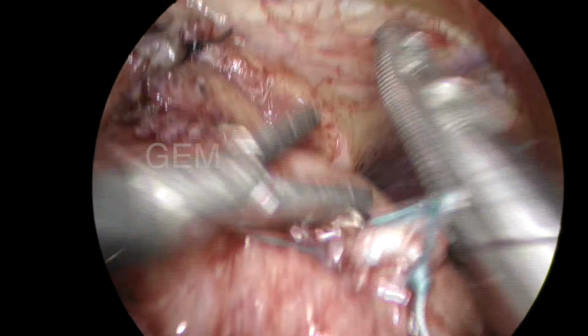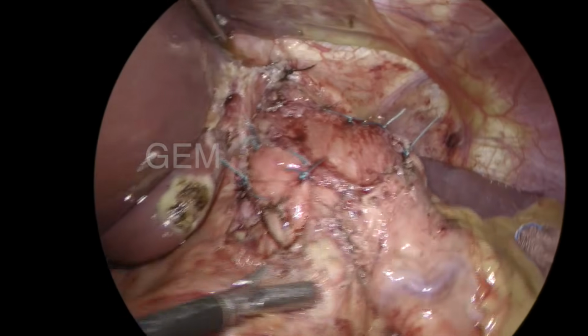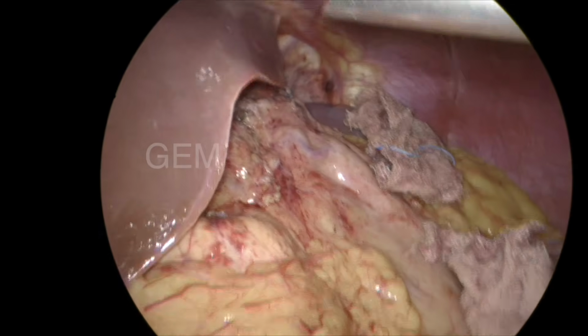So good exposure of the mucosa is seen, and this completes the laparoscopic redo Heller's cardiomyotomy for recurrence after laparoscopic Heller's myotomy.